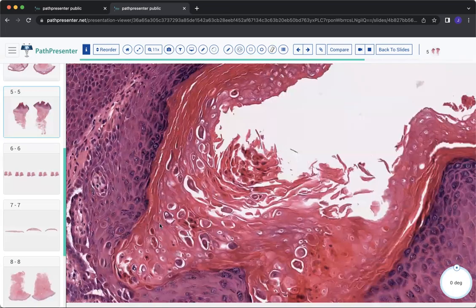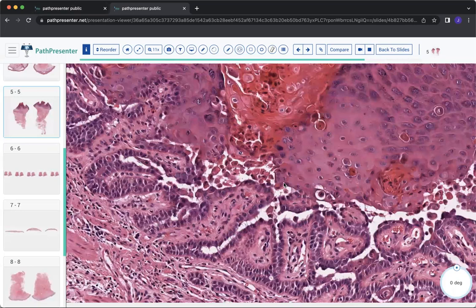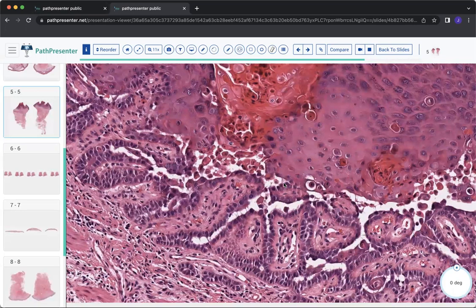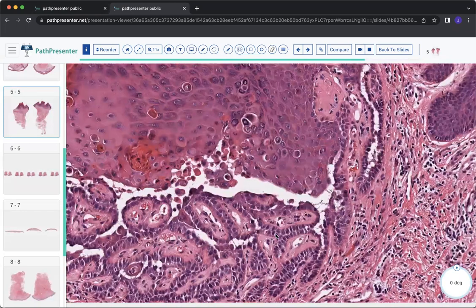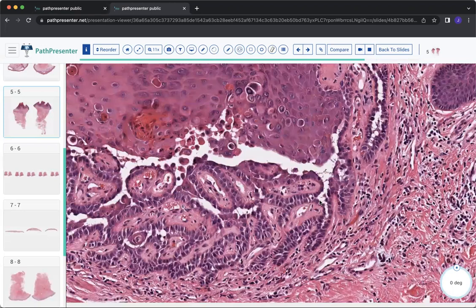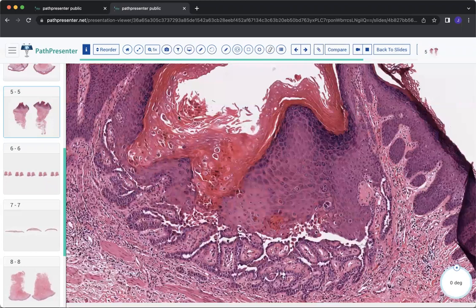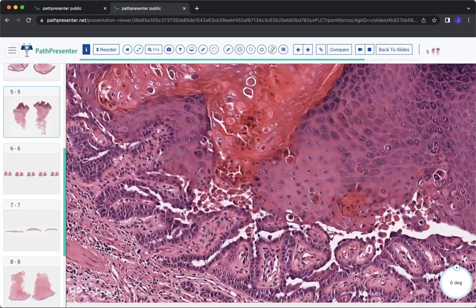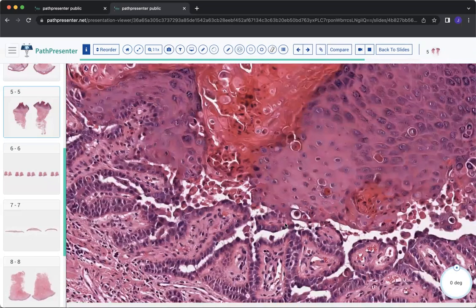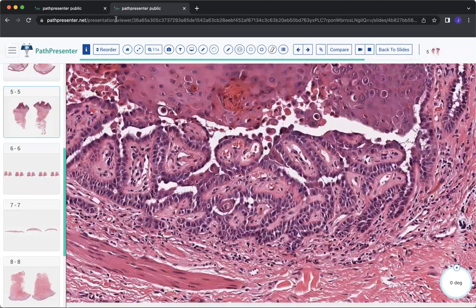When you see this pattern of acantholysis and dyskeratosis, if it's an actual rash on the person, a multi-location lesional skin disease, then you can think about Darier's disease, which is a mutation in ATP2A2. Now, interestingly, if this is just a single lesion located on the skin, a kind of endophytic cup-shaped lesion like this, warty dyskeratoma is the diagnosis. Both Darier's disease and warty dyskeratoma have been found to show defects in ATP2A2.